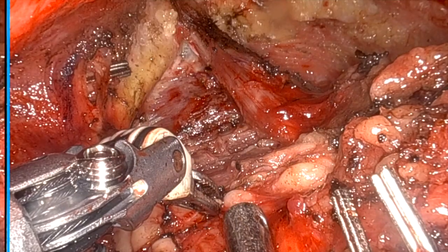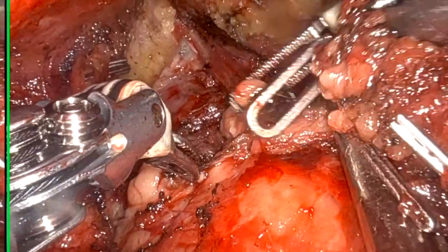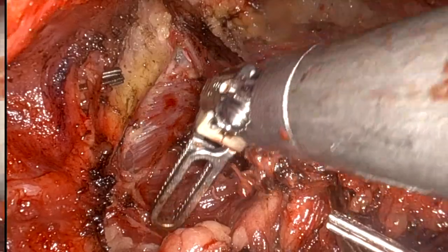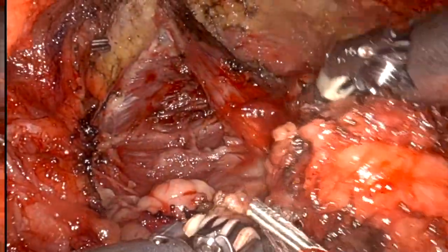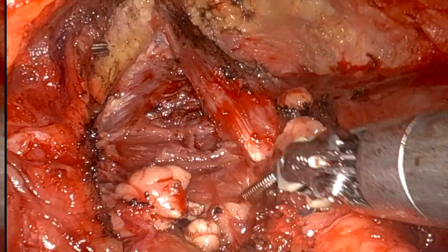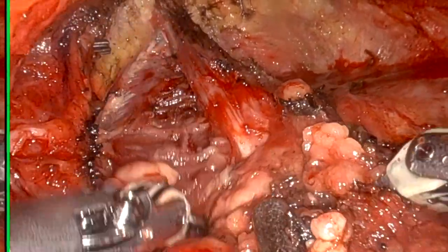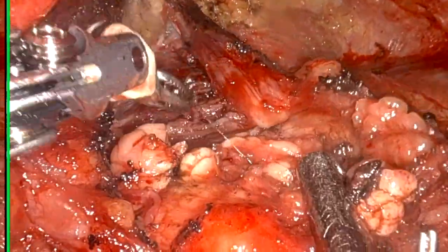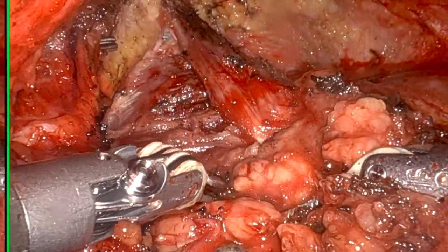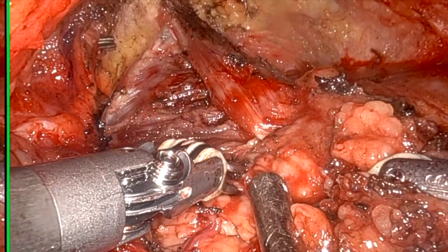I have already told you that I like bipolar in both arms. So this is the reason why. Here is the reason. Gently, I am trying to look under the mylohyoid muscle.